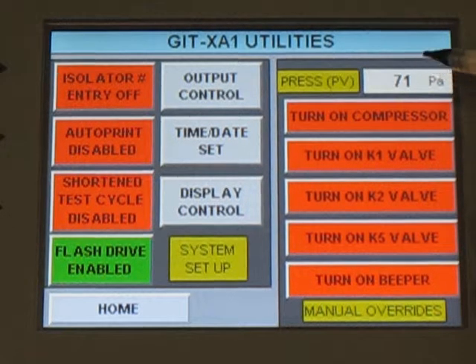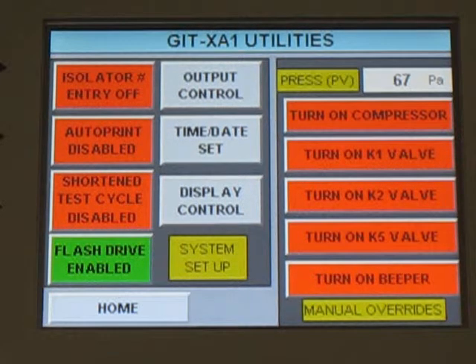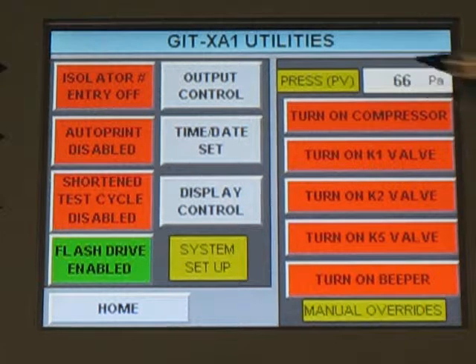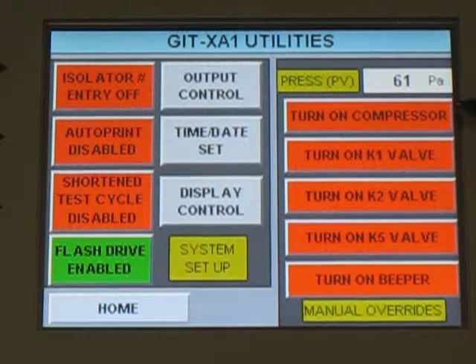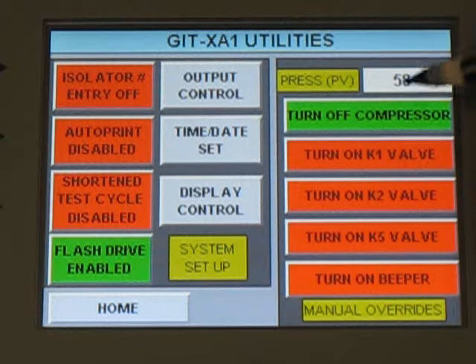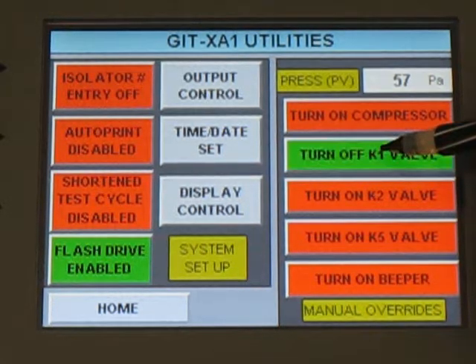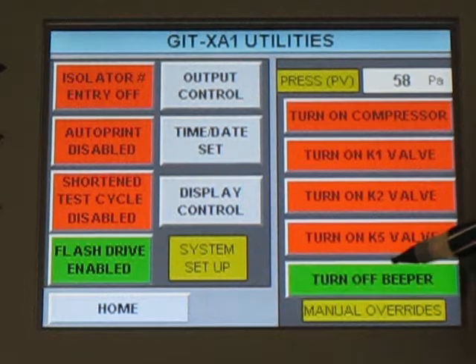What you see here is a pressure PV, which is the present value of the pressure that is being seen by the machine. We have the machine connected to a glove. So inside of this glove, there happens to be 65 pascals of pressure. And so this is a real-time reading of the pressure value. Below that, there's a compressor, turn on and off, and these are manual functions. You can hear the compressor come on and off. There's one valve, another valve, and here's the beeper.